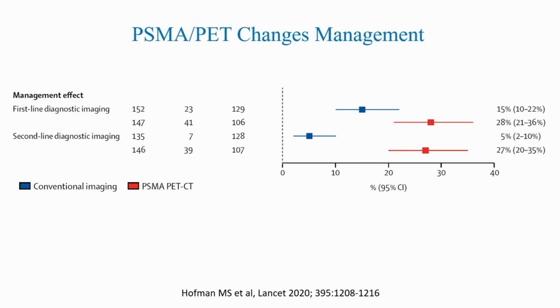And in this study, they also determined that PSMA PET changed management. And so accordingly, in 28% of patients who underwent PSMA PET as first-line imaging, they underwent a change in management compared to 15% of patients who underwent standard imaging or the conventional imaging group.